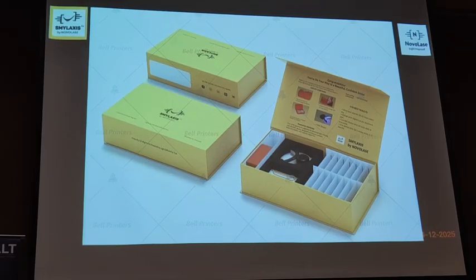So how it works? By accelerated tooth movement. Let me show you that. The patient has to wear this 30 minutes in the morning and 30 minutes in the evening, along with the aligners. Okay.